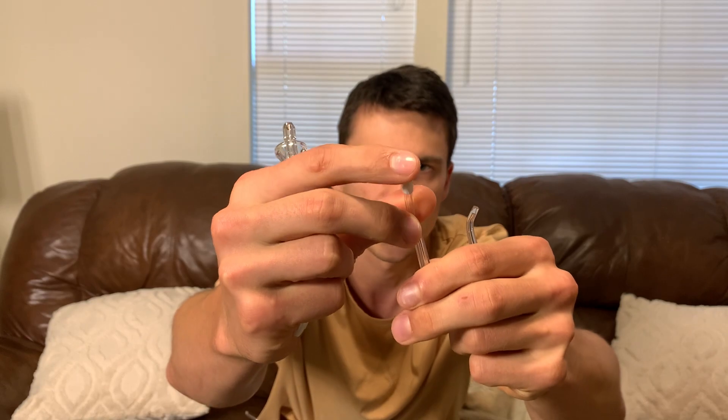It does come with a charger, of course, and then a couple of different tips — some more irrigator tips and one that has a little bit of bristle, so you can kind of brush your teeth while using it. There are a bunch of different little attachments, which is pretty cool. But the standard irrigator tip is the one I've been using.